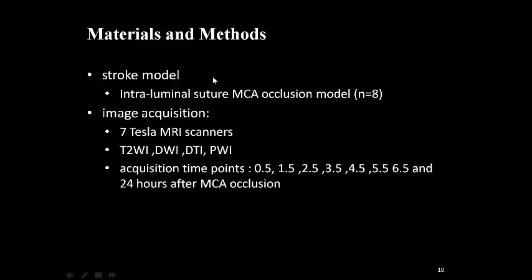This experimental procedure was approved by the local Institute of Animal Care and Utilization Committee. Male rats were prepared for permanent MCA occlusion using the intraluminal suture.